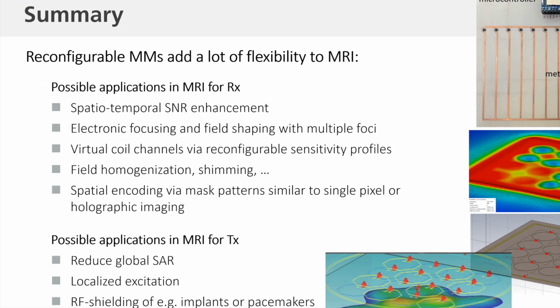And you can easily extend it to 128 or 256 without adding additional receive channels. I think it's not replacing any receive coil. It's just extending its capabilities without the very high hardware overhead you might have for your receive part. Can you independently record these 128 channels?